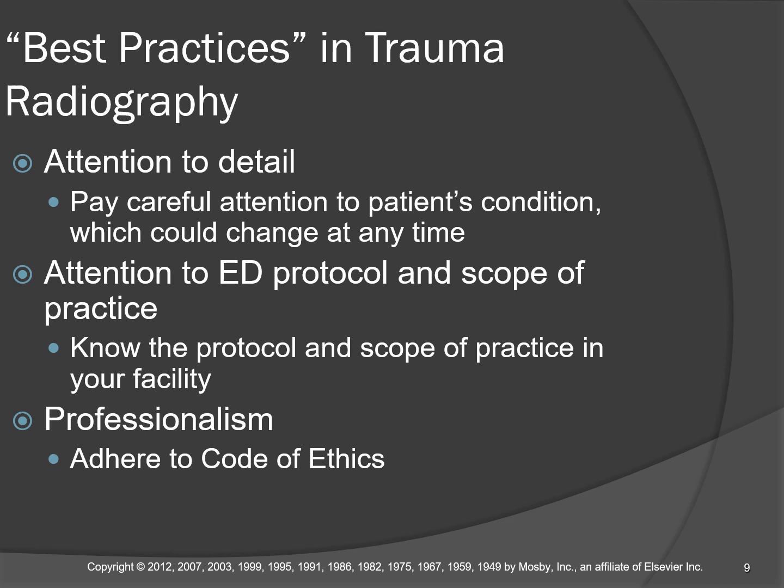Attention to detail. Pay attention to the patient's condition, which could change at any time. Remember, this is also traumatic injury, so in between you thinking and hot dogging your way into a new orientation for the cassette and the x-ray tube and figuring out how to get the shot, your patient might be crashing the whole time.